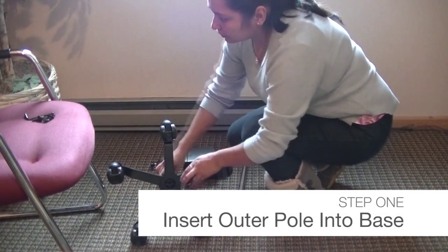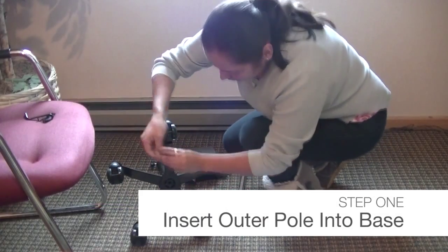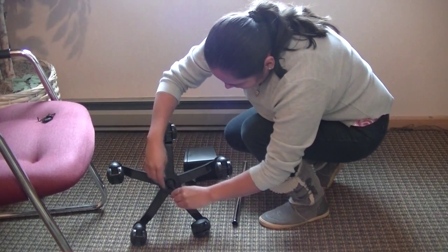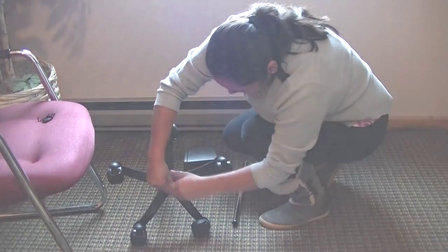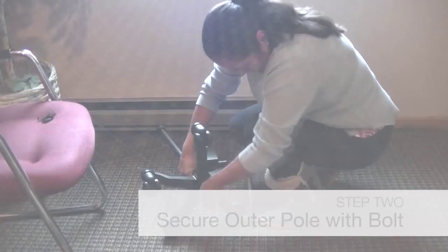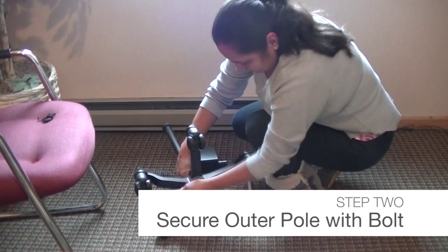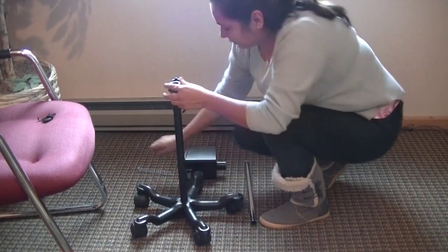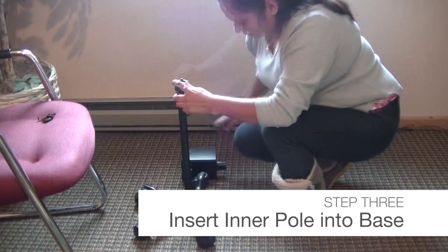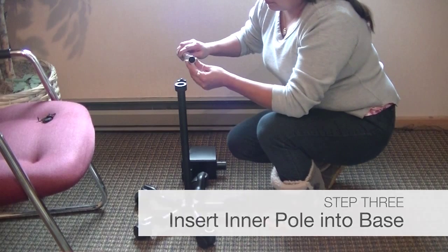To begin, place the wheelbase of the stand on its side and connect the outer pole using the 6mm Allen bolts. You may occasionally need to re-tighten these bolts as they may loosen over time. Turn the unit upright. Insert the spring into the bottom pole. Insert the stainless steel inner pole into the outer pole with its open end up.